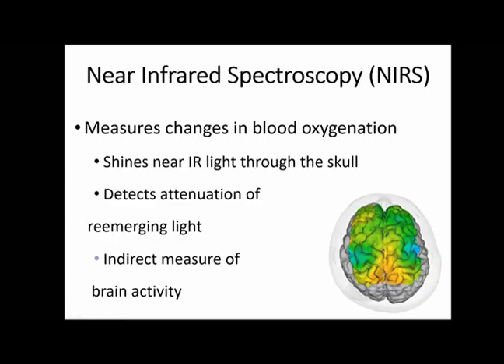And now we're going to start getting into some of the weird ones, because the first batch of them are the standard. You think of them as part of a normal medical setup. You go into an MRI and you get your brain scanned in the giant machine and all of that. That's pretty standard. The next couple are different, and you'll see why as we talk about them. The first different one is near-infrared spectroscopy, or NIRS.